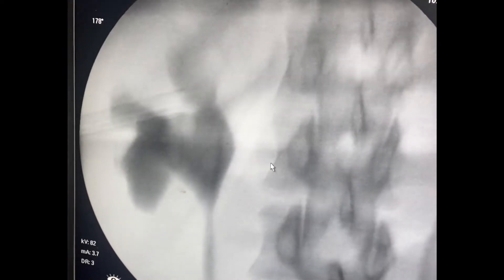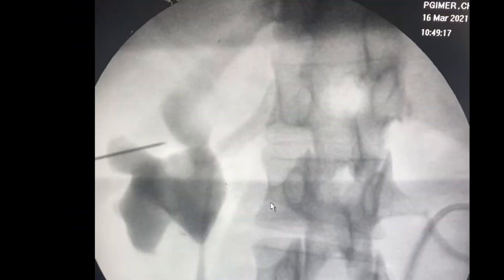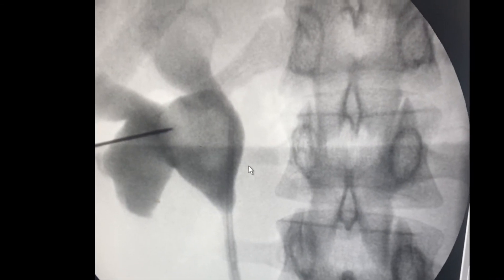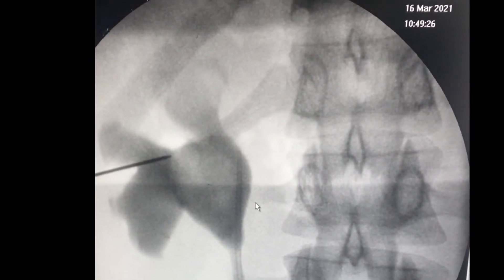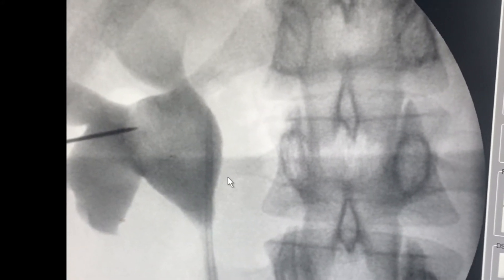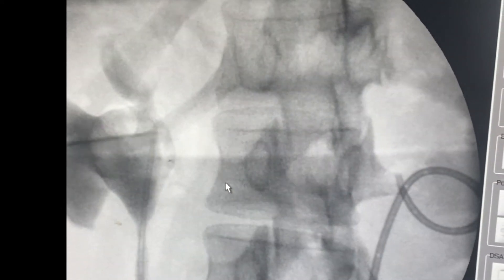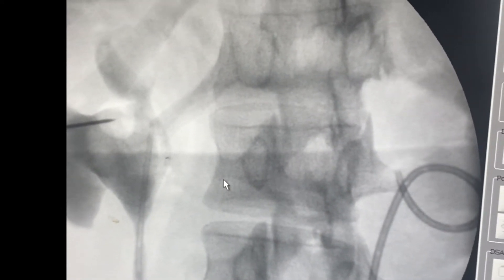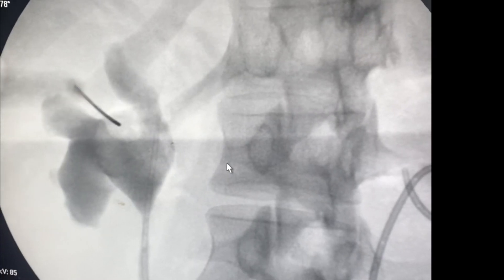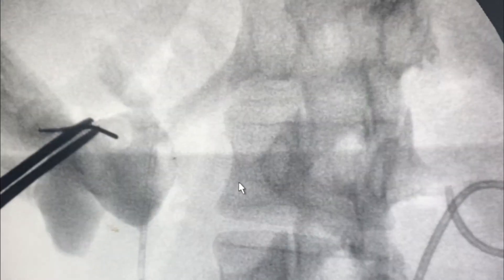To confirm whether it is the mid posterior calyx, the C-arm is rotated from 0 to 30 degrees. You can notice the calyx moves medially. On 0-degree C-arm, this faint area is visible, and when the C-arm is rotated to 30 degrees, it moves more medially, overlying the pelvis. A calyx that rotates from lateral to medial on 0 to 30 degrees is confirmed as the posterior calyx.